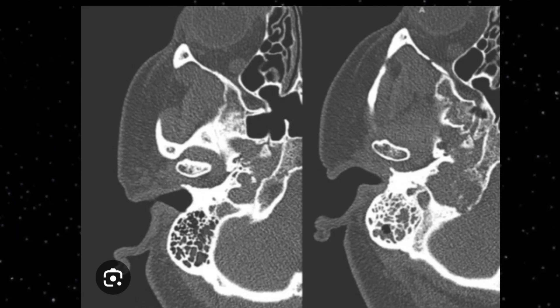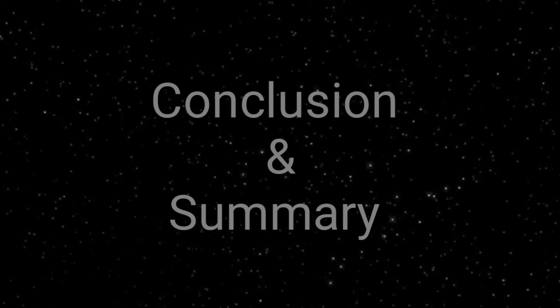To summarize, the glomus jugulare tumor arises from paraganglionic cells and gives rise to pulsatile tinnitus, deafness, and vertigo. In some cases it may cause lower cranial nerve palsies. On CT imaging, there will be moth-eaten bone destruction and enlargement of the jugular foramen — these two findings lead towards the diagnosis of glomus jugulare. Hope this was a useful video. With some other new video we will see each other; till then, take great care of yourself. Thank you.